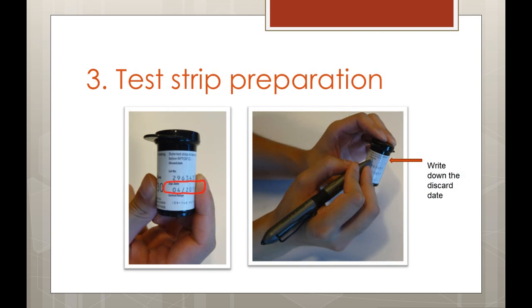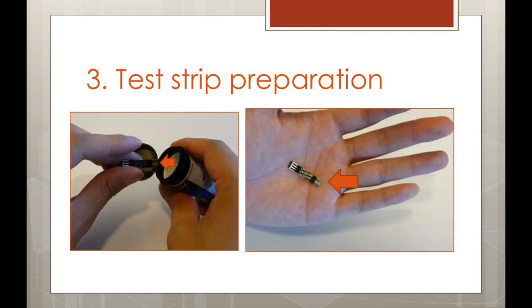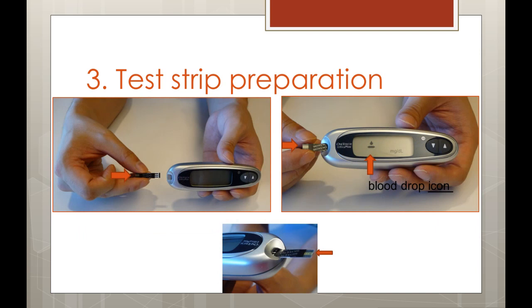Now it's time to prepare the test strip. First, check the expiration date on your vial of test strips — this vial expires 6 months after it's opened. Write down the discard date in the area listed on your vial. Next, take one test strip out of the vial and note which end has the narrow channel where you will be collecting your sample. Insert the test strip into the glucometer with the narrow channel on the outside. The glucometer may turn on automatically or it may need to be turned on manually. The blood drop icon on the screen indicates the glucometer is ready for a sample. Different glucometers may have different indicators, so be sure to read your manual.